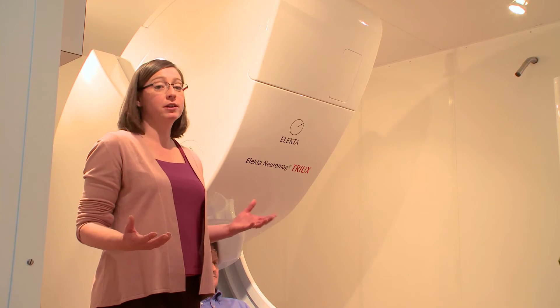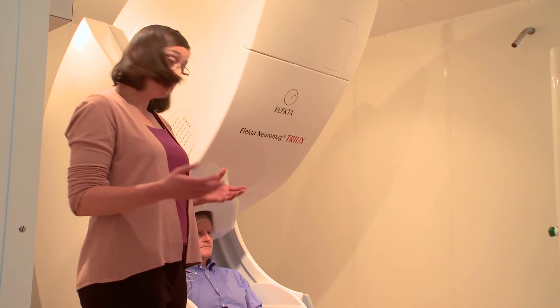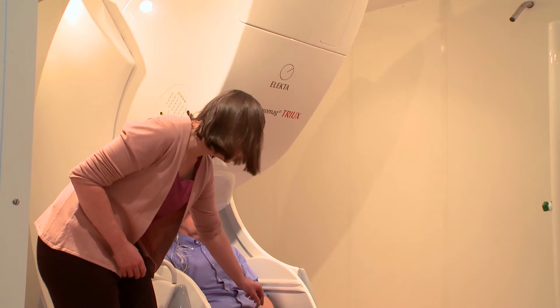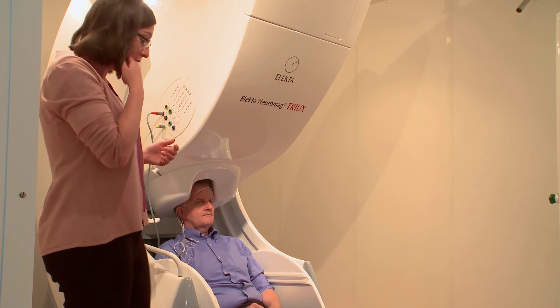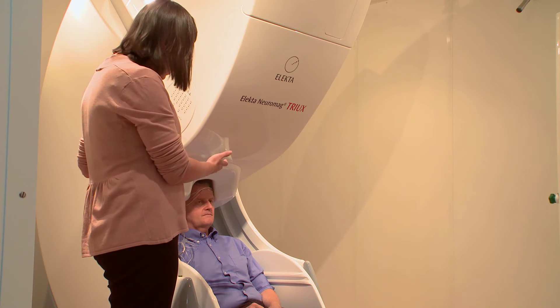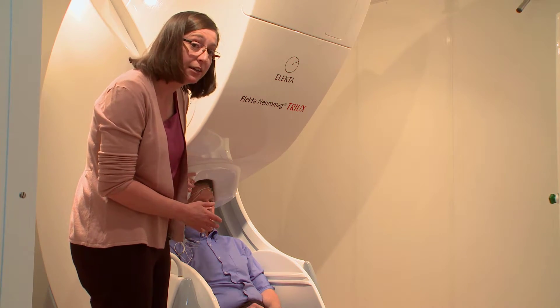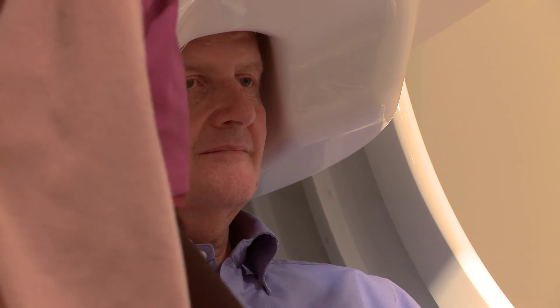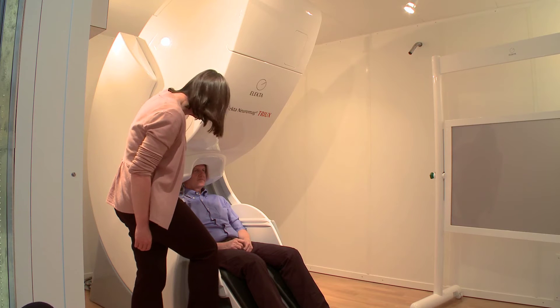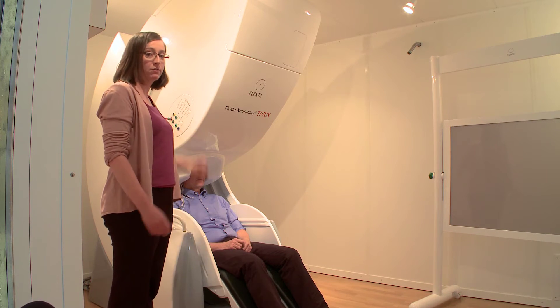The camera is not allowed in this room because it's made of metal, but hopefully you can see what we're going to do next. First of all I'm going to plug Stefano's coils that we stuck on earlier into the MEG system, and then raise Stefano up in his chair so that his head is inside this helmet here. His head is now in the right position and we're ready to record.